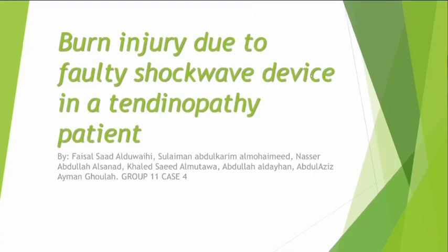So today I'm going to talk about burn injury due to a faulty shockwave device in tendinopathy patients. Actually, just before we go and explain this lecture, I just want to give you some simple information, which is that the shockwave device is actually used on chronic tendinopathy patients.